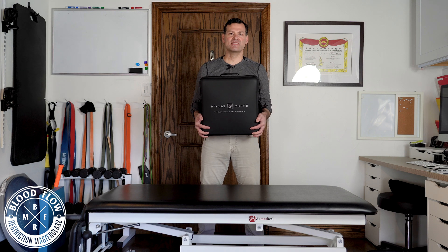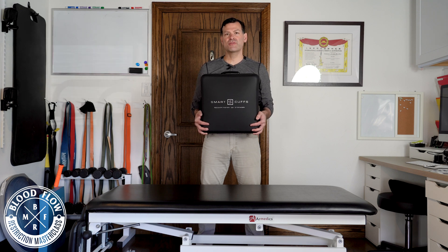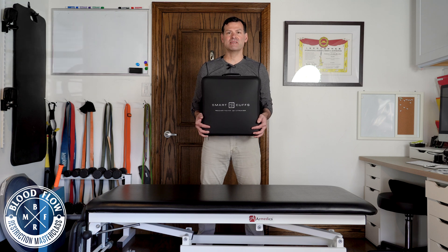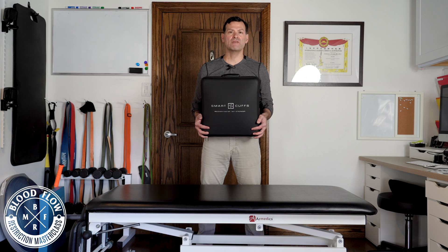I want to show you what's inside of this awesome clinical set of Smart Cuffs Blood Flow Restriction Training. What's really cool about these is there's been about three years of development into these cuffs. They're as evidence-based as possible, and they're also FDA listed, which is really rare because there's only two cuffs on the market — ours is one of them that is FDA listed as a class one medical device.